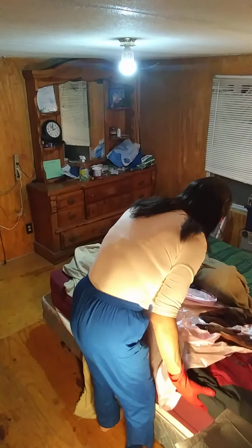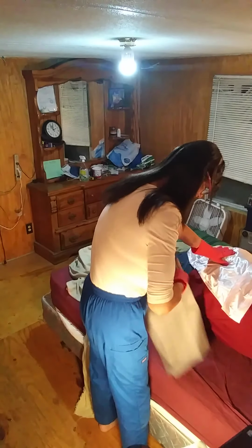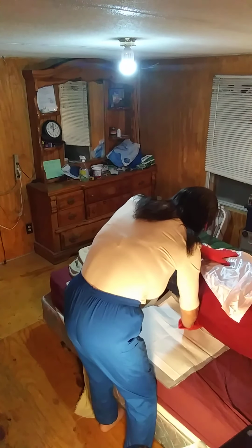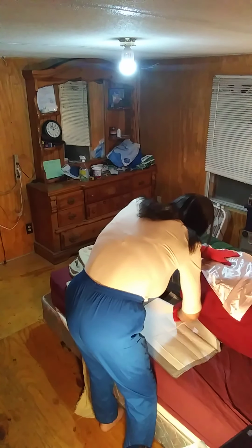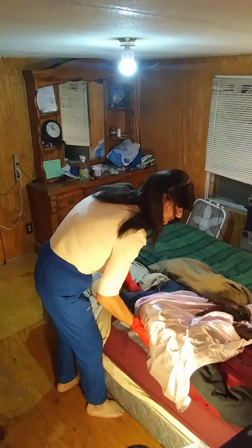Alright. Ready? Your arms are crossed. Raise knee. On 3. 1, 2, 3. Roll. Okay, I'm going to hold you in position and I'm going to spread my linen protector out, making sure that I get it underneath her buttocks. Alright. Okay, carefully roll her back over. Straighten your legs out so you have proper body alignment. Okay.